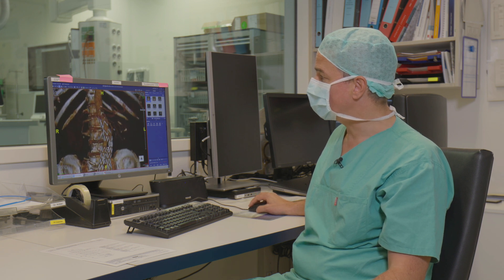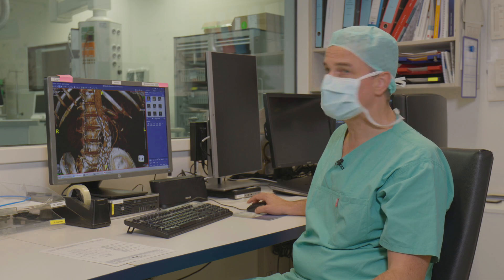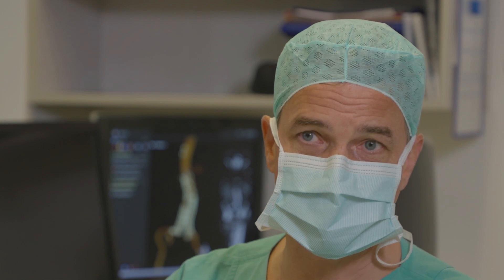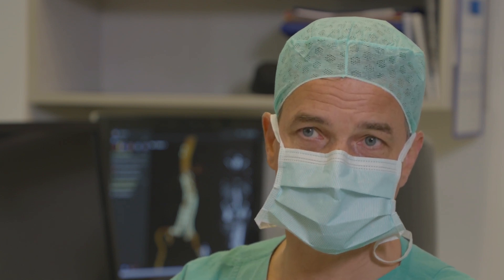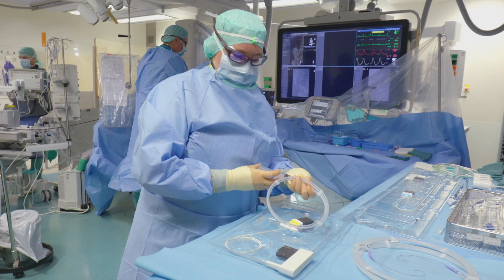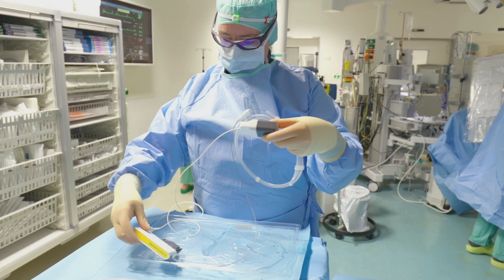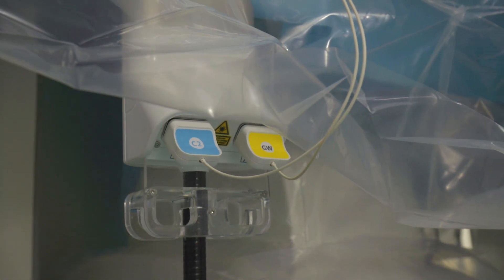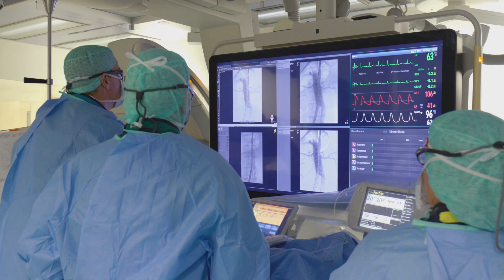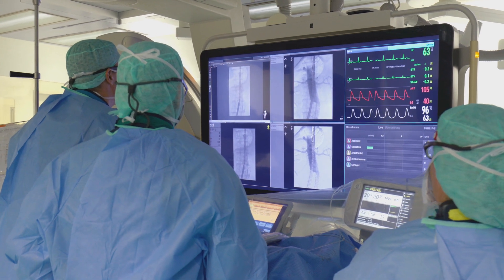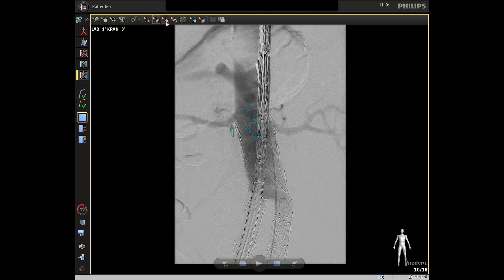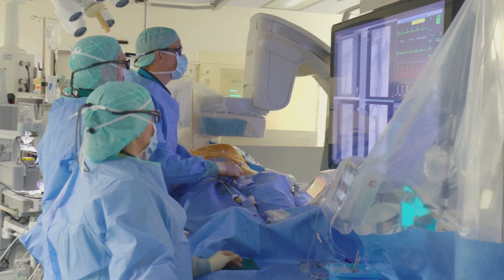This is one of the reasons why we expect a specific benefit in this procedure from the FOSS technology, which offers us 3D visualization of the target vessels and of the materials that we use. This is the docking base, how it is installed, and the wire and catheter that needs to be connected to the table-mounted part of the FOSS system. The next step in fenestrated repair is to open partially the fenestrated device, rotating it into the correct position and longitudinally adapting it.